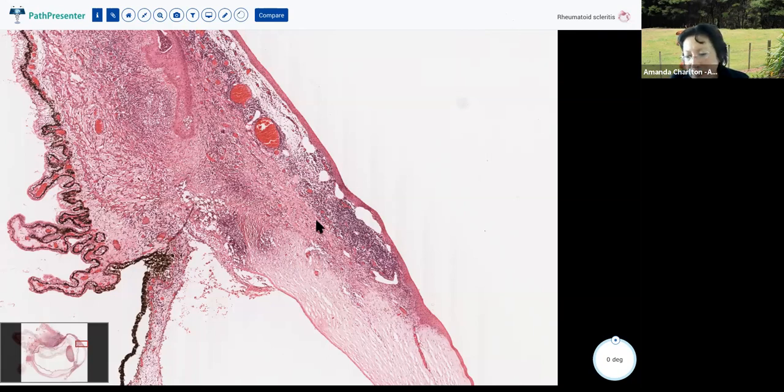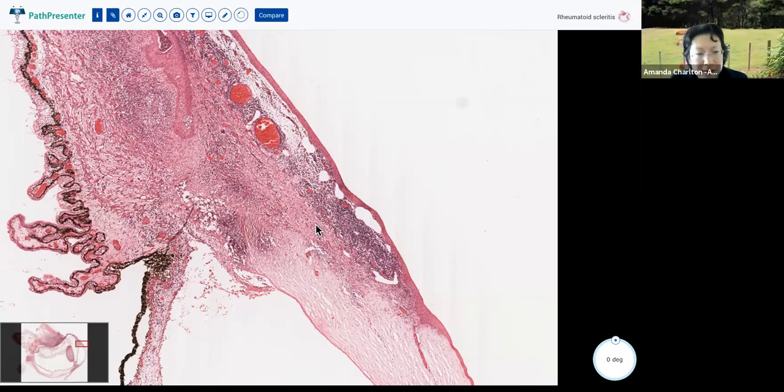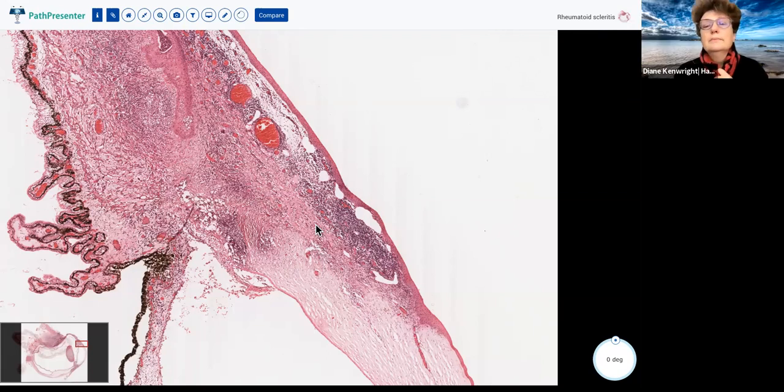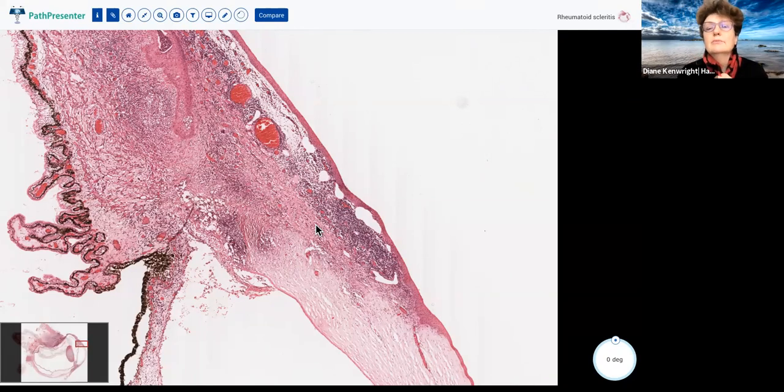I thought we could call some of this pannus even, because of the neovascularization, the inflammation all creeping underneath the epithelial surface. So, was there limbitis? Yes, there was. Evidence of PUK? What's PUK? Peripheral ulcerative keratitis. I didn't think there was. Reactive in the inferior cornea.